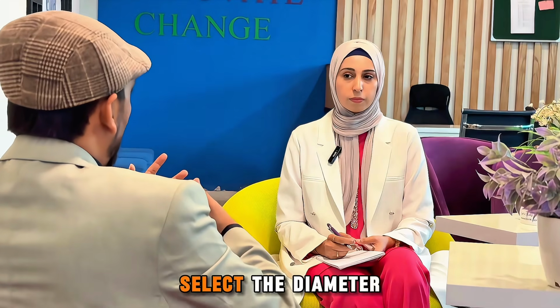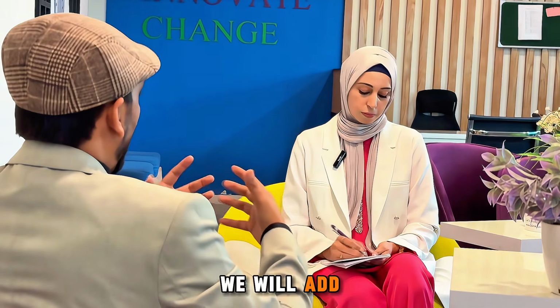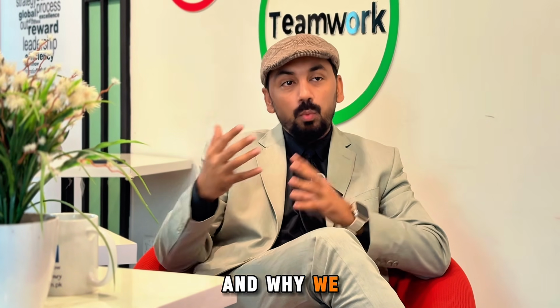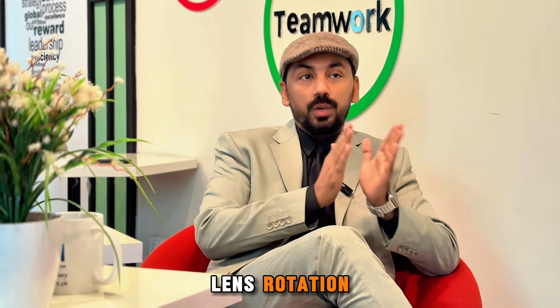But when we select the diameter for toric contact lenses, we will add some points to the total diameter. Like if the total diameter with HVID plus 2 mm is 14.5, we will not select 14.5, but we will add some more points, like it will be 14.7 or 14.8. And why are we doing this? We are doing this to avoid the lens rotation.